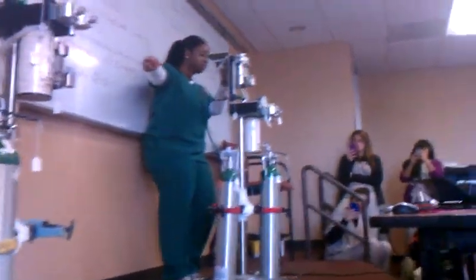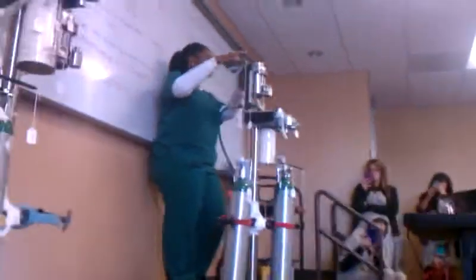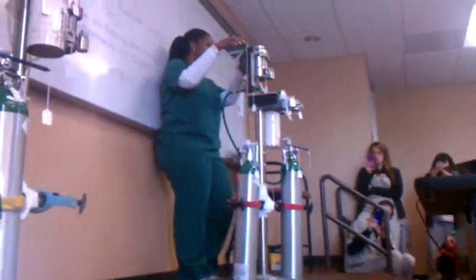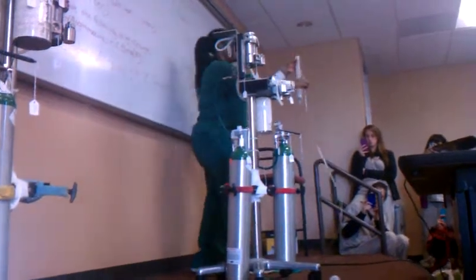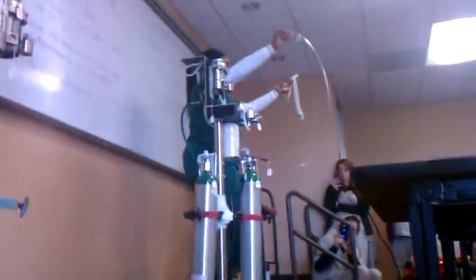It's going to be different than your setup from the previous machine. So we're going to set up this machine with a non-rebreathing system — the system that we use for small patients. Here is the non-rebreathing system without all of its parts.